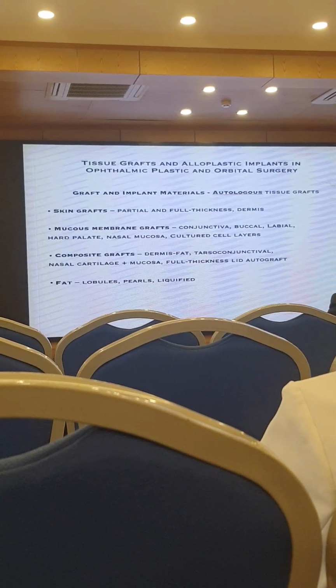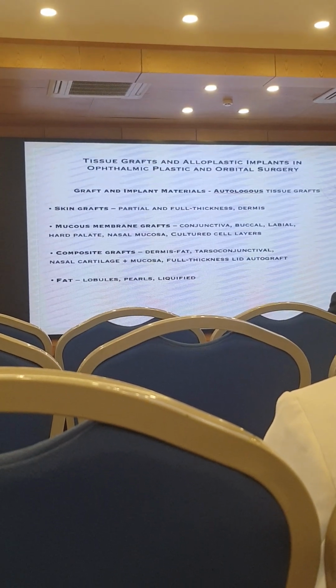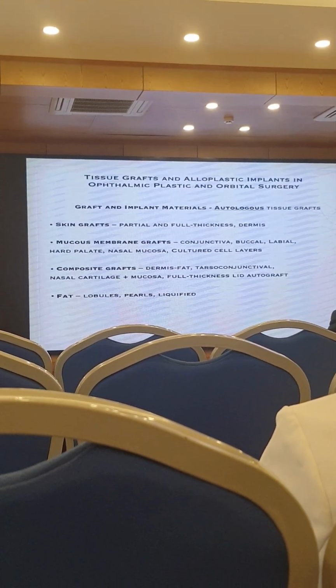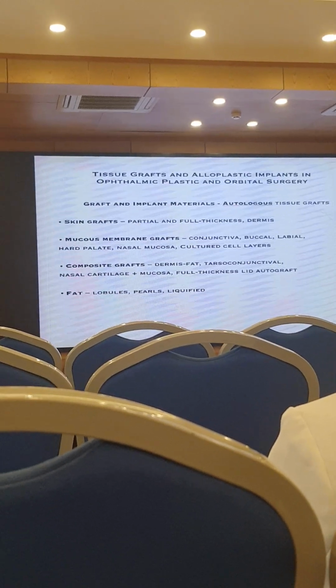Now I'm going to show you just some of the types of grafts and implants that we use in oculoplastic surgery. We'll go through a few examples. I have a separate lecture, and I'll put that in the folder. You'll all have access to it. I have a separate lecture that's a 1-hour lecture just on grafts and implants in oculoplastic and orbital surgery.